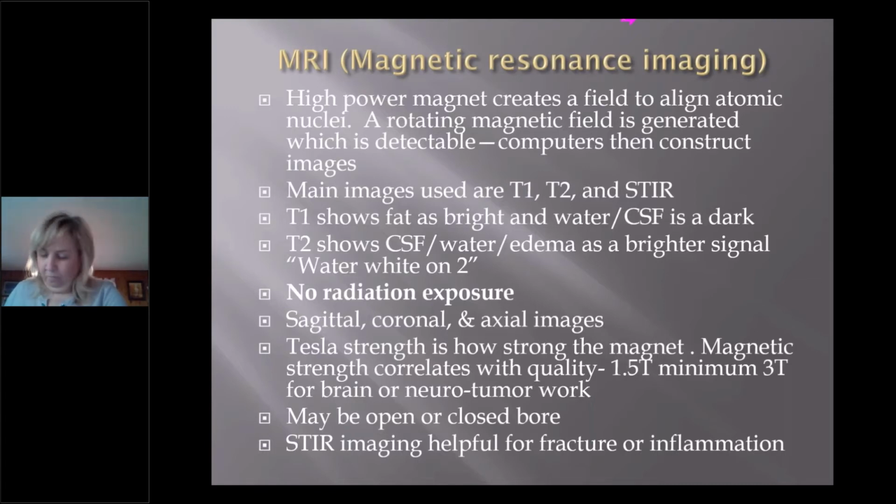So when you get MR imaging, MR primarily gives you sagittal and axial reformat imaging. Occasionally you'll get coronals if you ask them, but overwhelmingly, at least from a spine standpoint, certainly in musculoskeletal, you can get coronal, sagittal, and axials. You don't have to ask them, they just come that way.